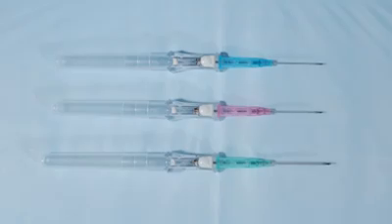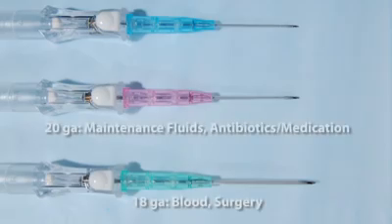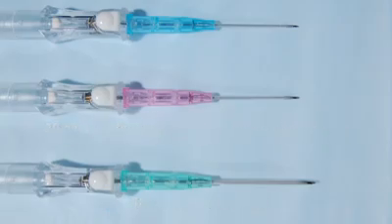Angios are numbered based on diameter. The higher the number, the smaller the diameter. They are also color-coded based on size. Most often a 20-gauge angiocath is chosen if the patient is receiving maintenance fluids or antibiotics and medication. If the patient is going to receive blood or go to surgery, an 18-gauge angiocath is required.